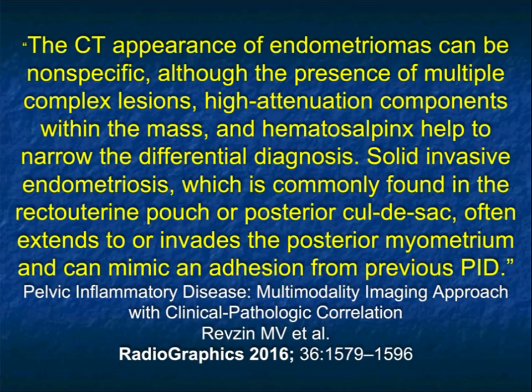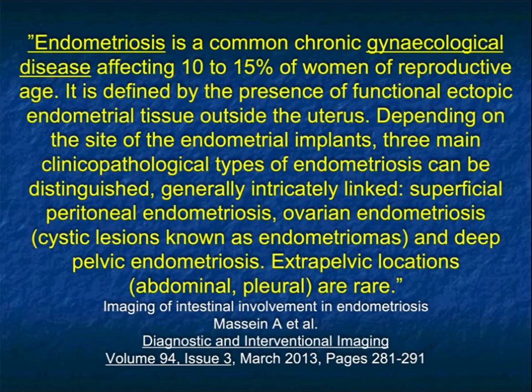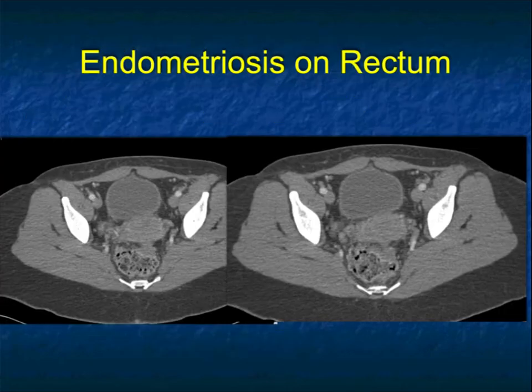The appearance of endometriomas can be nonspecific, although the presence of multiple complex lesions, high attenuation components within the mass, and hematosalpinx help to narrow the differential diagnosis. Solid invasive endometriosis, commonly found in the recto-uterine pouch or posterior cul-de-sac, often extends to or invades the posterior myometrium and can mimic an adhesion from PID or malignancy. Most of the time on CT, you're not going to see a lot, particularly when there are small endometriomas, but there are a number of unusual presentations.